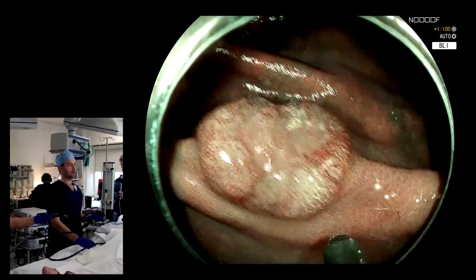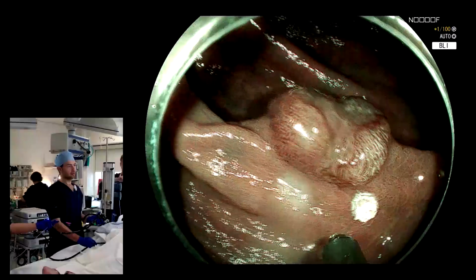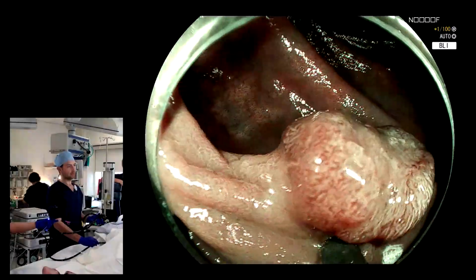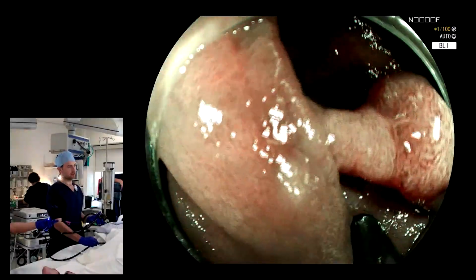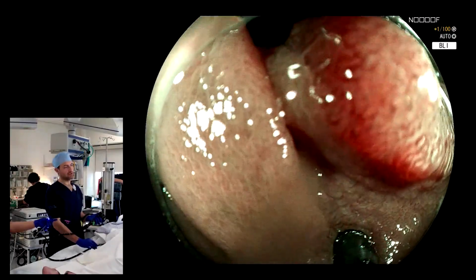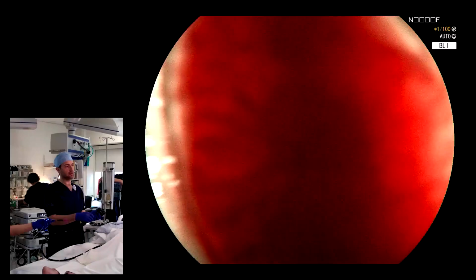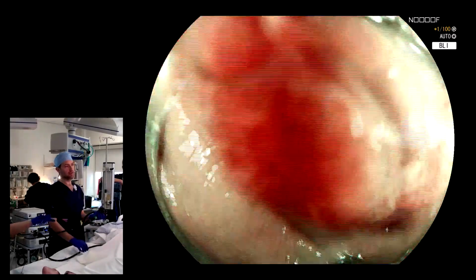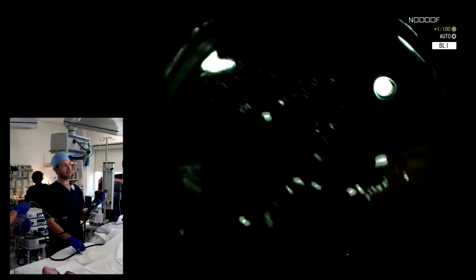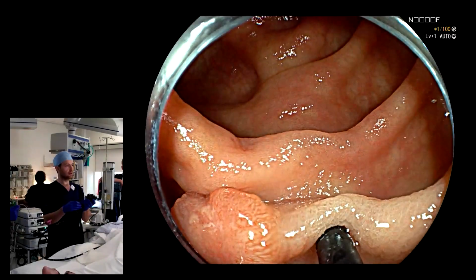Okay, so here we're going to go with the mark. I'm using soft coagulation. These marks are just so you can see what you've got in your cap. Well, maybe it's not totally clear to you. So you see there's quite a bit of hidden mucosa under here. I don't want to really mark there because that's not the edge of the lesion. So I'm going to go in here. Maybe it's easier to mark that with water. I'll show you that in a second. Let's get out of BLI and go into standard light.